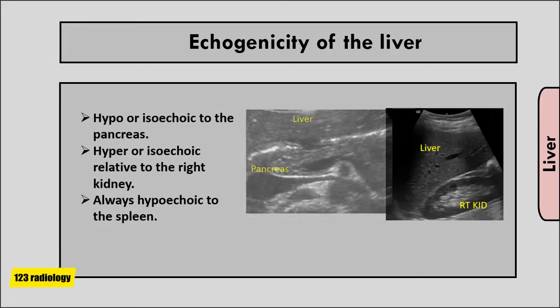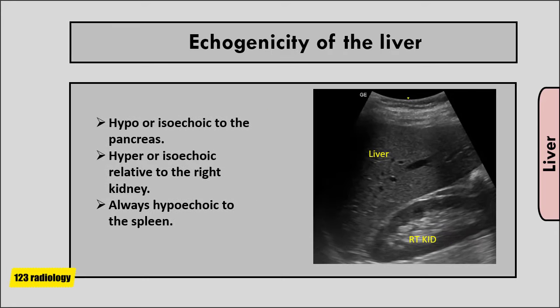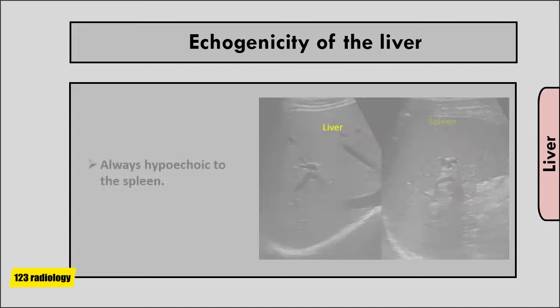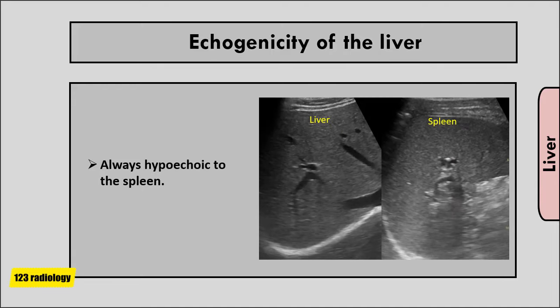Looking at images, we see the liver adjacent to the right kidney, and the liver is hyperechoic relative to the right kidney. In another example showing the liver and spleen, the liver is hypoechoic relative to the spleen.